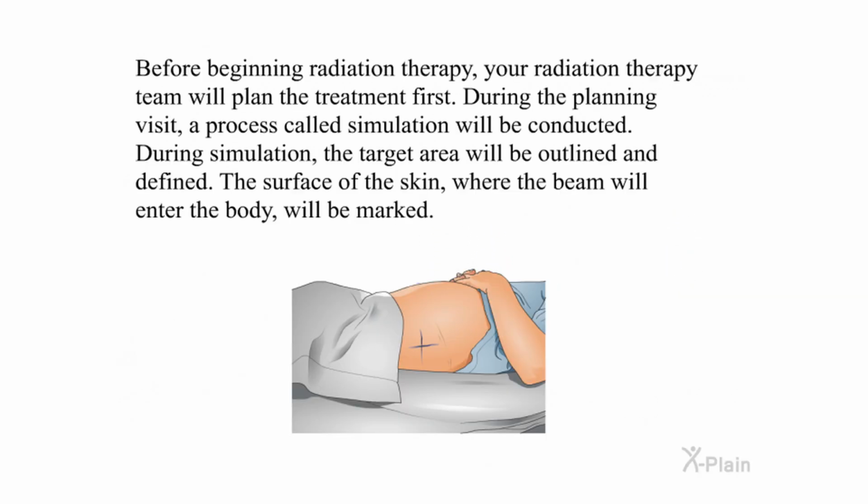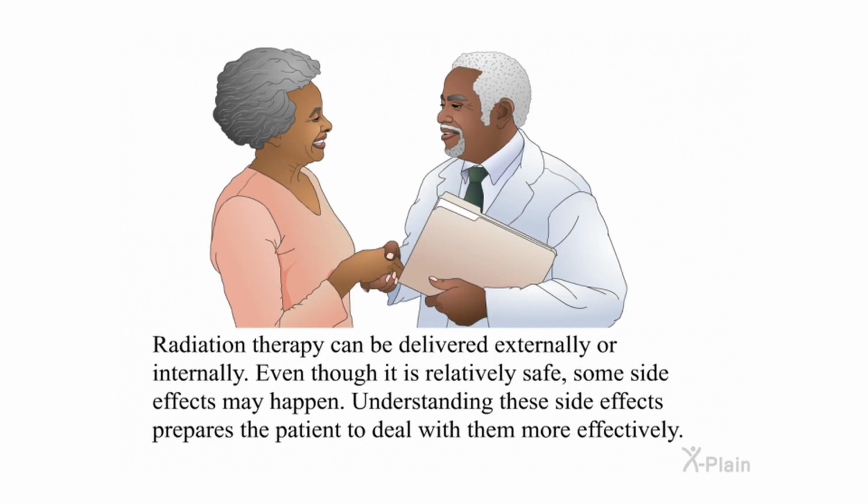Before beginning radiation therapy, your radiation therapy team will plan the treatment first. During the planning visit, a process called simulation will be conducted. During simulation, the target area will be outlined and defined. The surface of the skin, where the beam will enter the body, will be marked. Radiation therapy can be delivered externally or internally. Even though it is relatively safe, some side effects may happen. Understanding these side effects prepares the patient to deal with them more effectively.